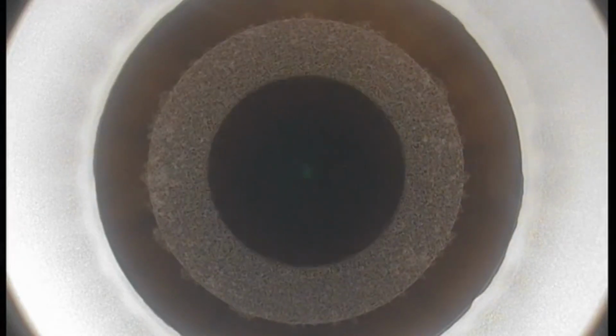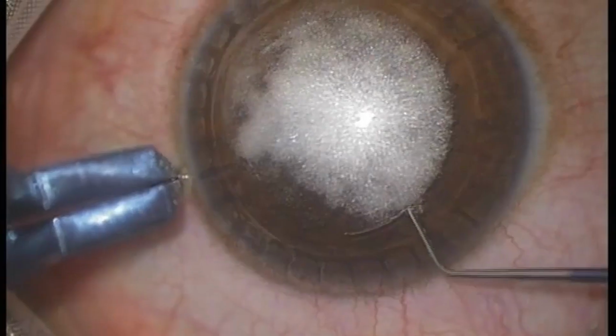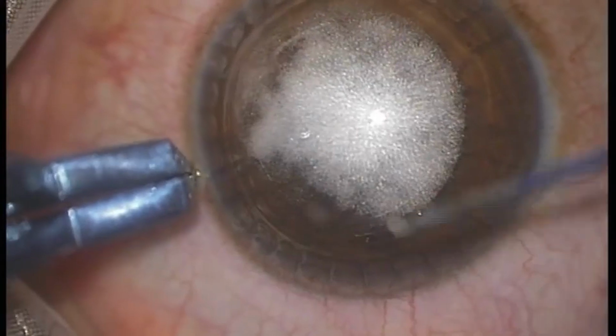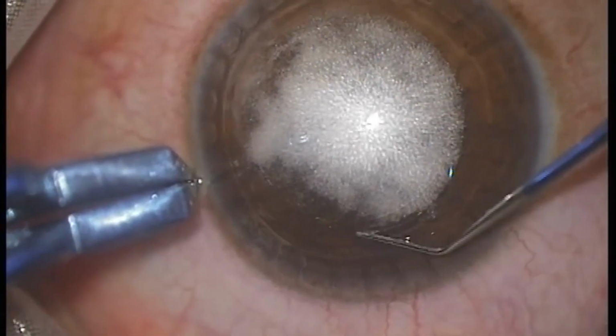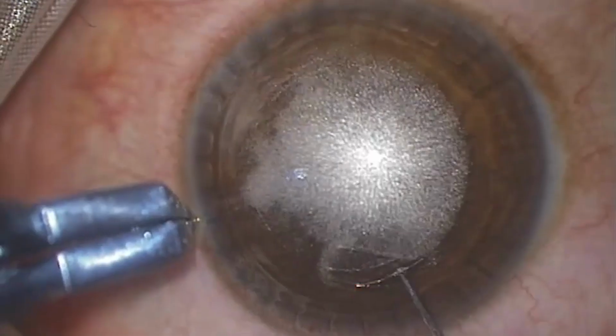This was a case of moderate myopia undergoing SMILE. Femtosecond laser application was completed. The hooked end of the dissector was used to open the cap side cut. The same instrument was used to facilitate small anterior plane pocket creation.